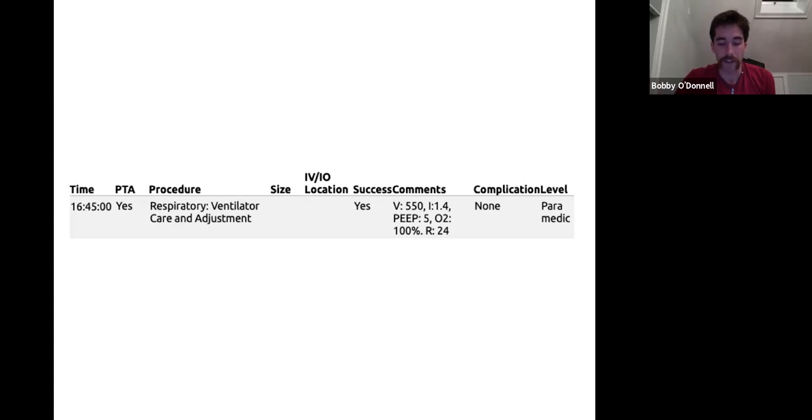Did you use a HEPA filter? Did you need to change the sedation agent? Did you need to ask for pain meds? Did you need to ask for the vent settings to be allowed to be titratable? And additionally, one thing I'm a little bit curious about is if you clamped the ET tube when you're transferring onto our vent. And that's something we'll go over when we talk about vent settings specifically.